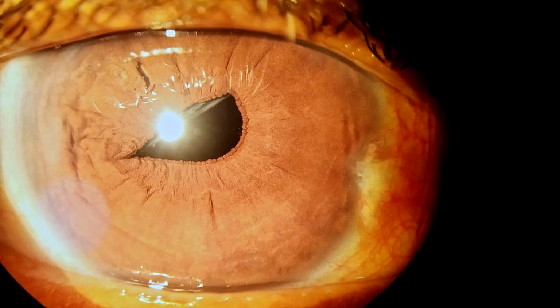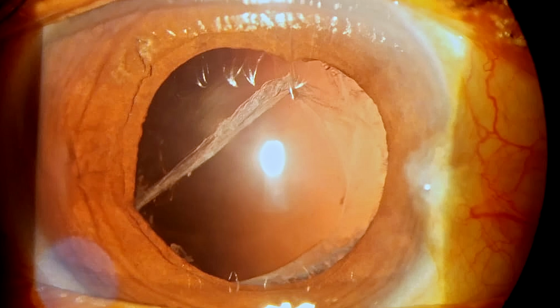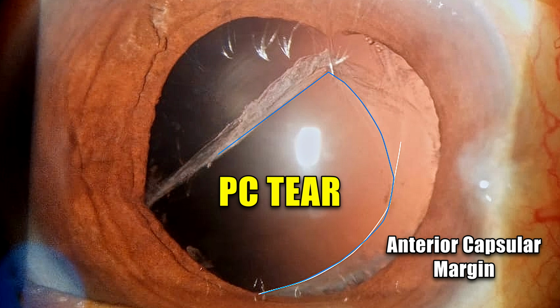Now, clinical examination shows a peaked pupil suggesting the presence of a vitreous band here. And this is the slit lamp picture after dilatation. We can see these two rings. It appears that this is a posterior capsular tear. The exact margin of the anterior capsular rim is not visible clearly.